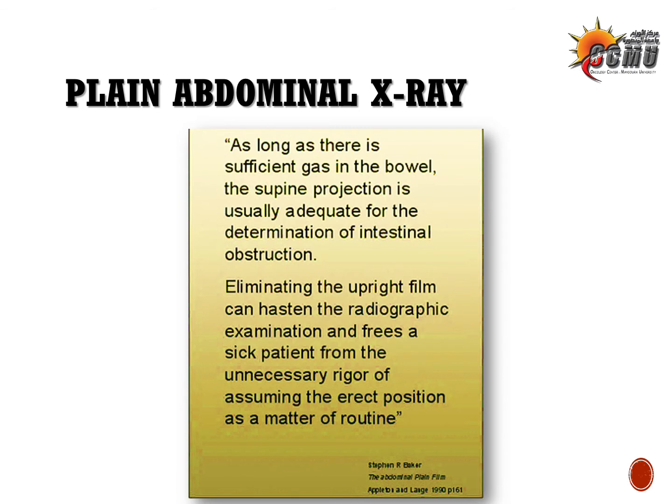Moreover, this is a quotation from the Abdominal Plain Film Bible by Stephen Baker. It says that as long as there is sufficient gas in the bowel in the supine view, and this gas is adequate for determining the site of intestinal obstruction, there is no need to do an erect film, because an erect film in a sick patient will be unnecessary and will cause unnecessary pain and rigor, and takes time. So it's okay if you omit the erect film in a very sick patient, if you could know the site of obstruction with a supine film.